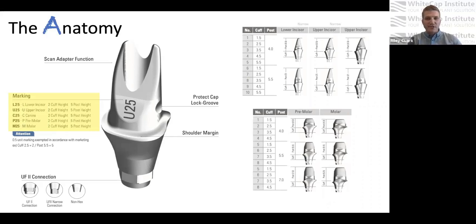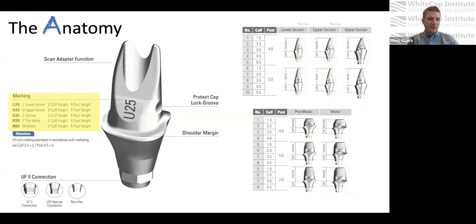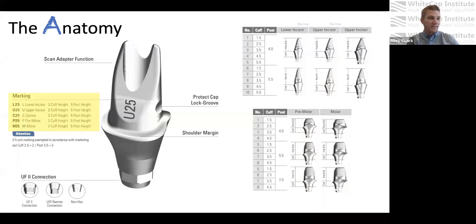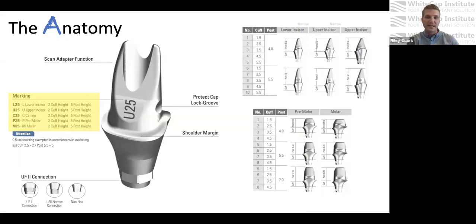On the posteriors, they go as high as seven millimeters tall, so there are different options. For example, an M47 would mean it's a molar with a four-and-a-half millimeter cuff height and a seven millimeter post height. If you were an office that was going to inventory these, you're going to want to be familiar with all of those numbers. That's the anatomy of this abutment and some of the different options that come with it.